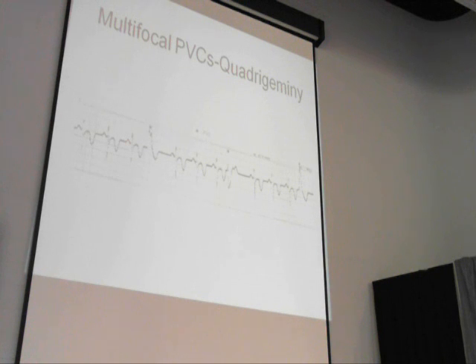Monitors are wonderful, but never ever treat them without going to check on the patient. PVCs are a very common dysrhythmia after an MI, in acute coronary syndrome, like you see in ACLS. Ventricular dysrhythmias are very common.